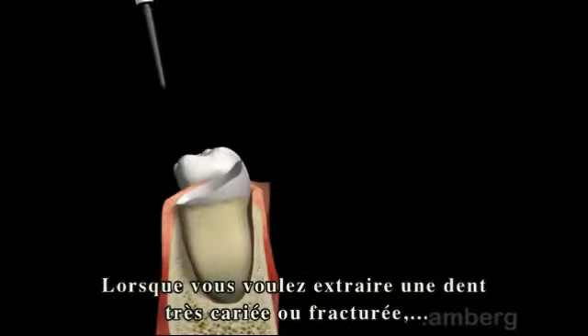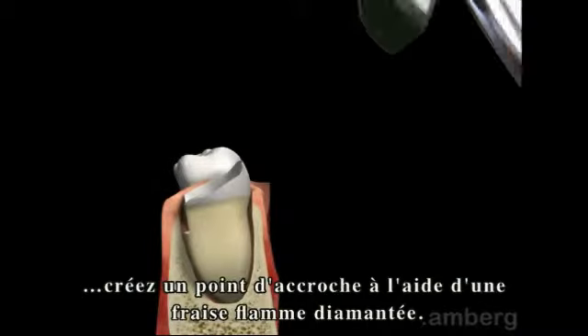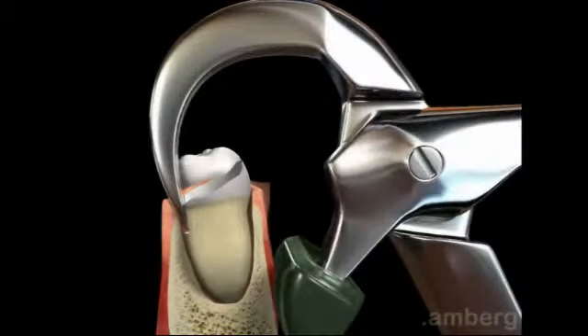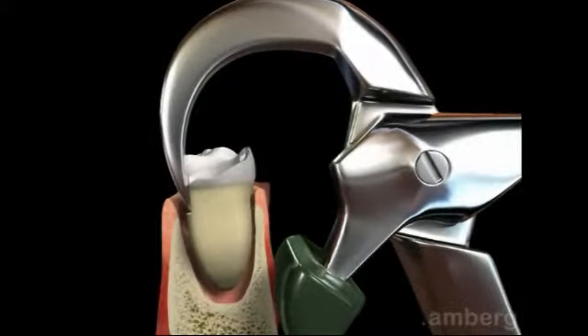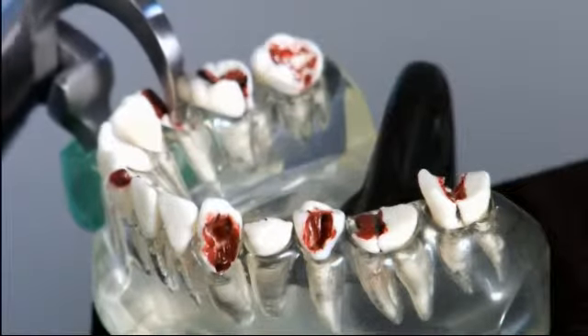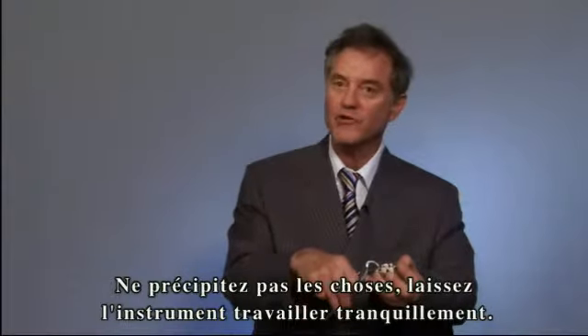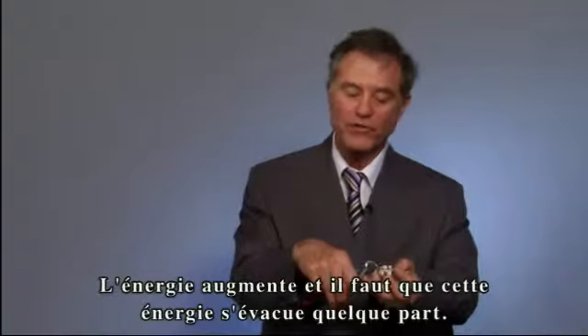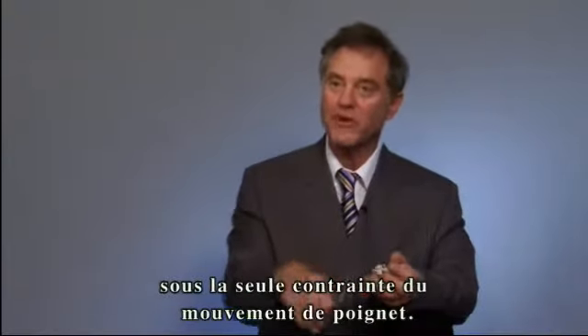When removing a severely decayed or broken-down tooth, create a purchase point by using a flame-shaped diamond burr. Don't rush the instrument — let the instrument do its work. Energy builds up, and that energy has to go someplace. That place is down the root; it separates the root from the bone, and the tooth, based on wrist movement, will start moving buccally.